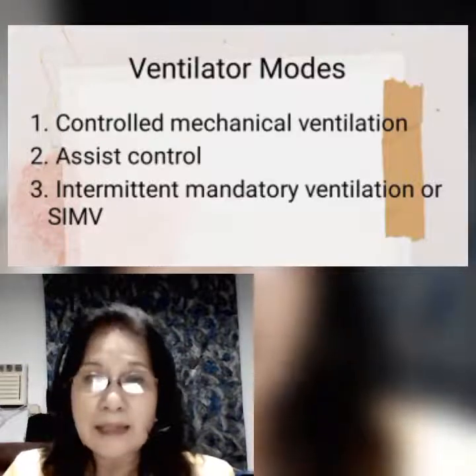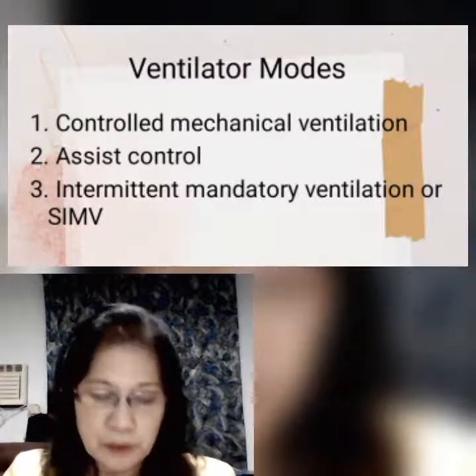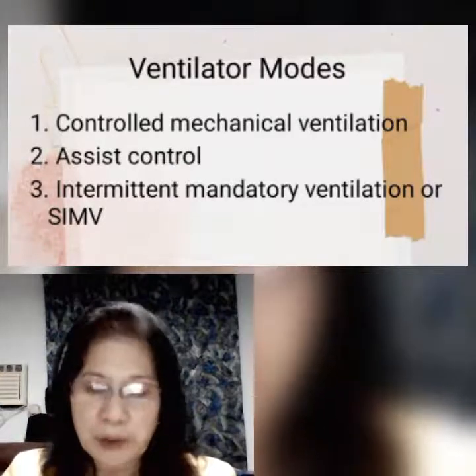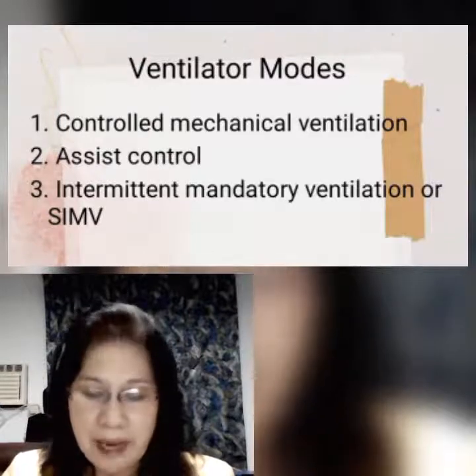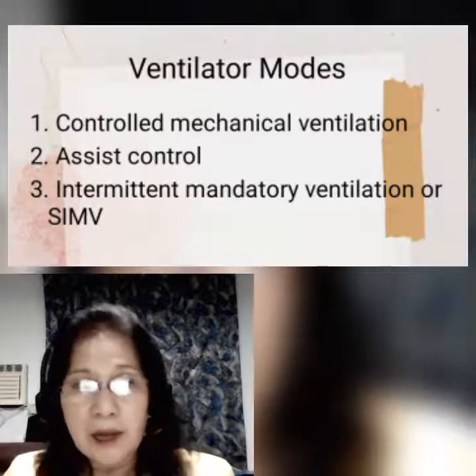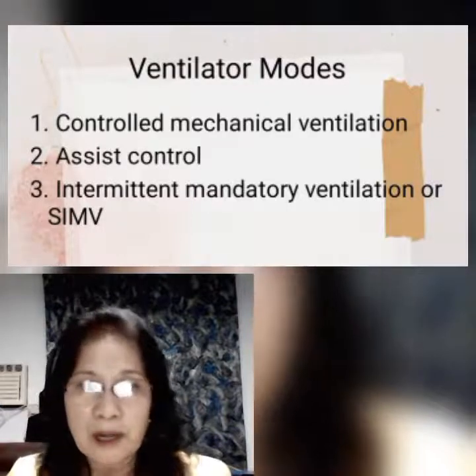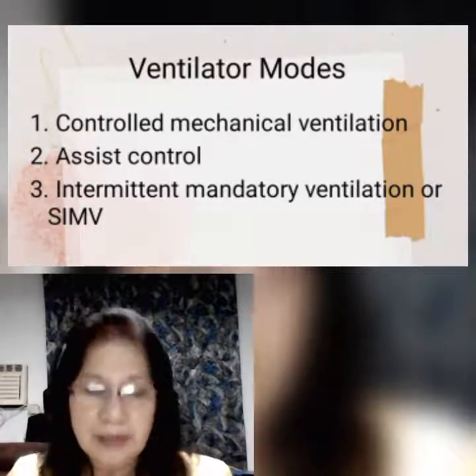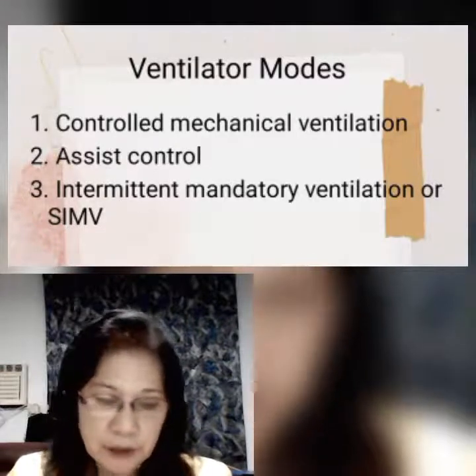because it is indicated in patients without deep sedation who are able to initiate respiration, but who cannot maintain spontaneous respirations. And of course, this kind of mode is a very friendly mode of the ventilator settings. Another one is intermittent mandatory ventilation.